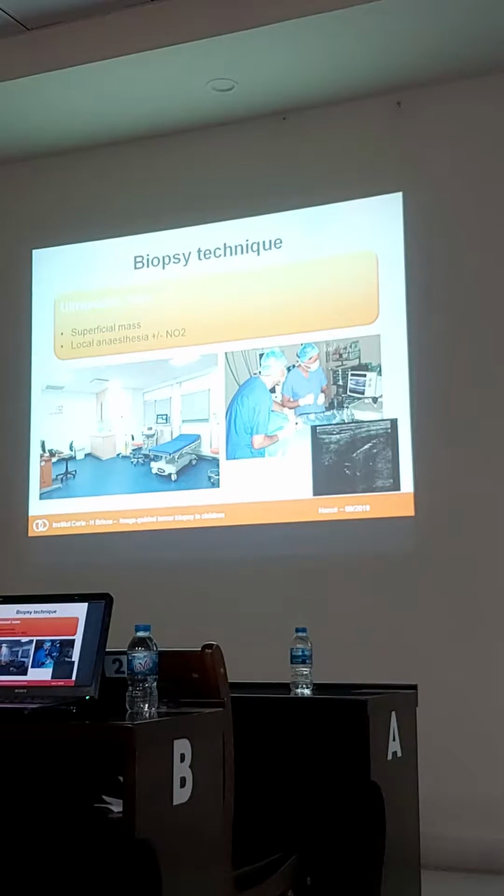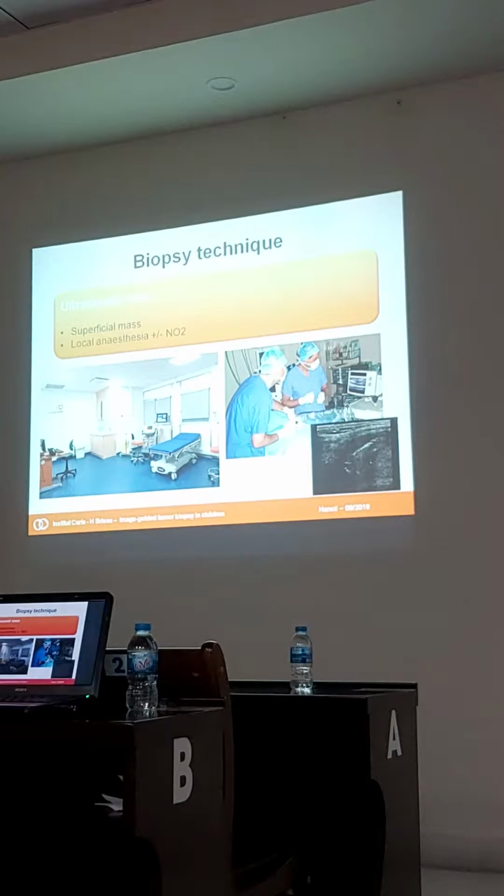So what is the method? It depends on the location of the tumor and on the age of the patient.